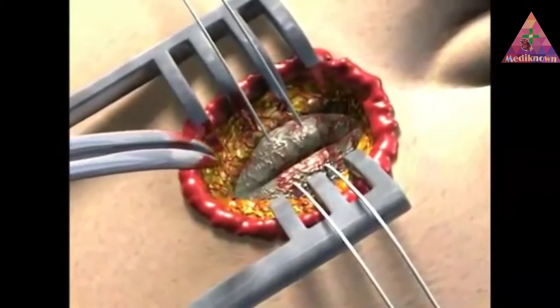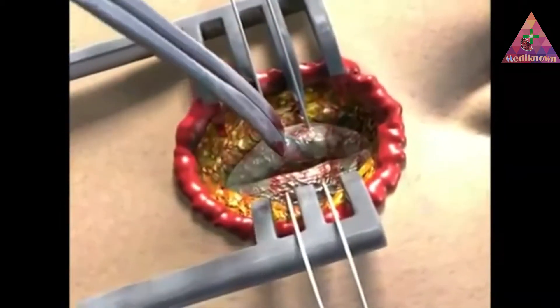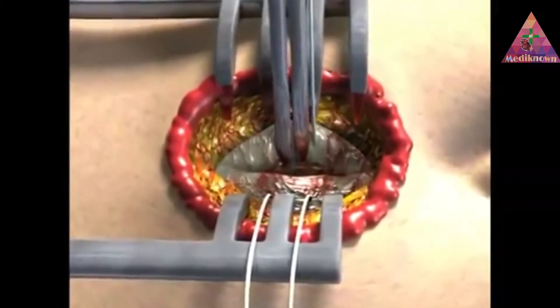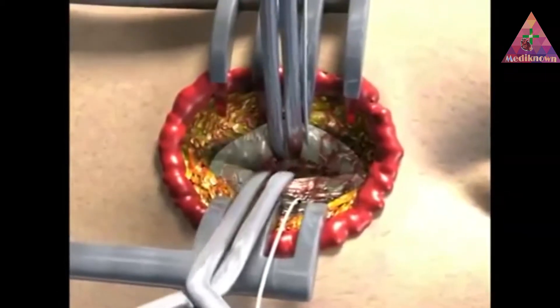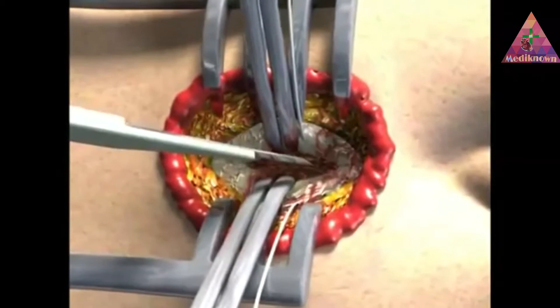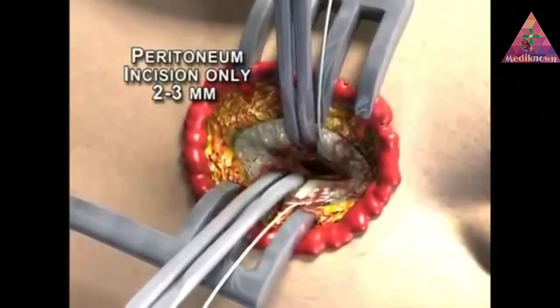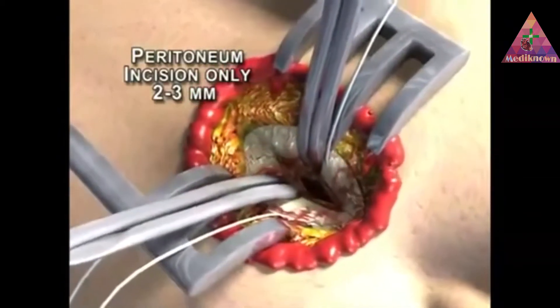The pre-peritoneal fat is then spread with retractors or a hemostat and the peritoneum is grasped with a hemostat. It is then grasped a second time a short distance away and tented up. The peritoneum is then incised sharply with scissors or a number 11 scalpel. The incision in the peritoneum only needs to be large enough to allow the insertion of the catheter, for roughly 2 to 3 millimeters.